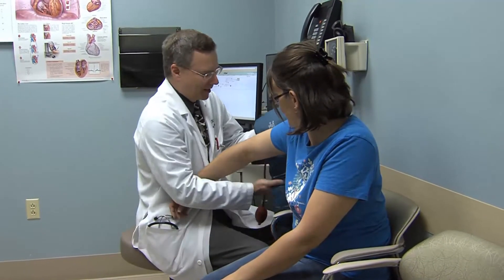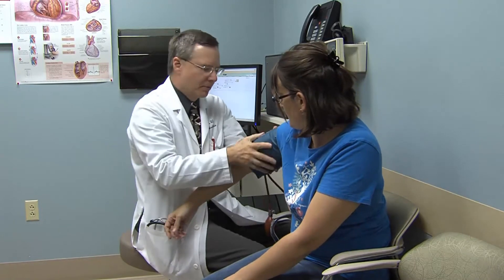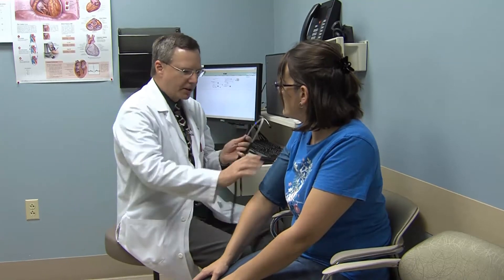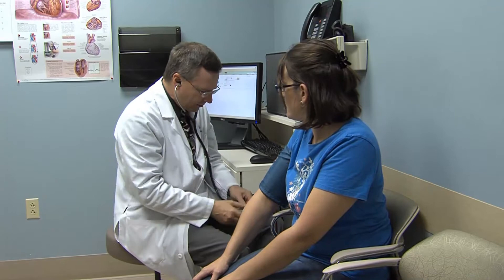Good morning Kim. I'm going to check your blood pressure here this morning. It's important when we check your blood pressure that your blood pressure cuff fits you adequately. So when you do home blood pressures, make sure that the cuff fits about two-thirds of the upper part of your arm in order to get an accurate blood pressure.